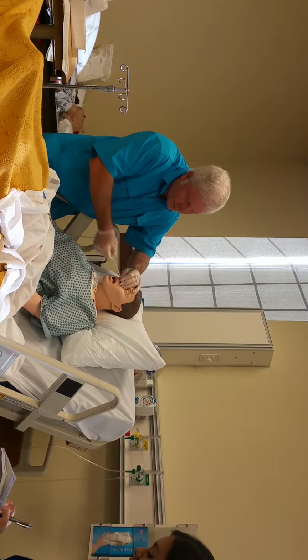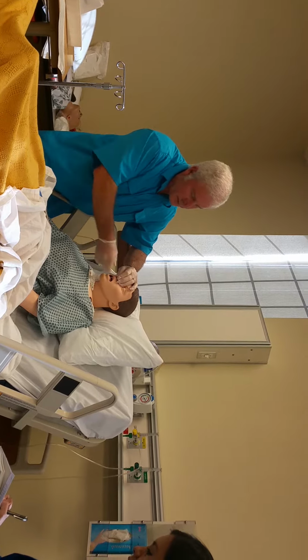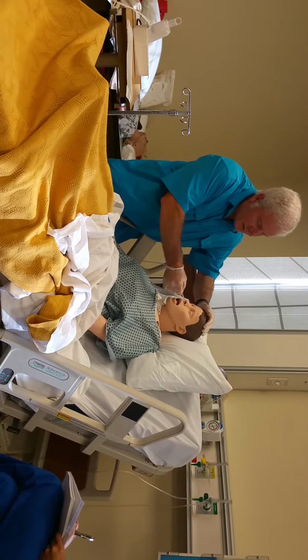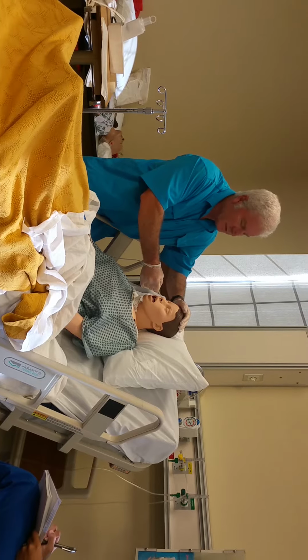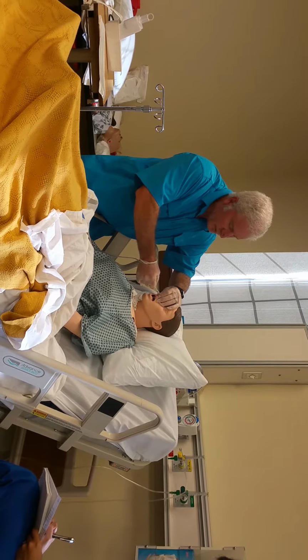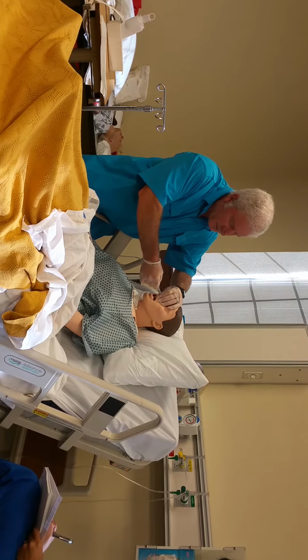And you can only go back a little bit. You go way back here, it's not going to do anything. You can only go back a couple inches at a time. And then once I got him swallowed and I advance, I'm just going to keep going as long as he can tolerate. Okay, swallow, advance. All right, swallow for me one more time, advance. All right, we just got a few more to go.